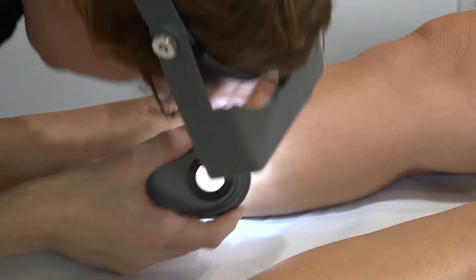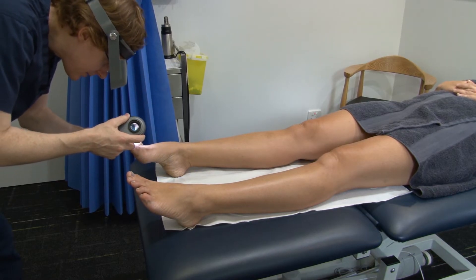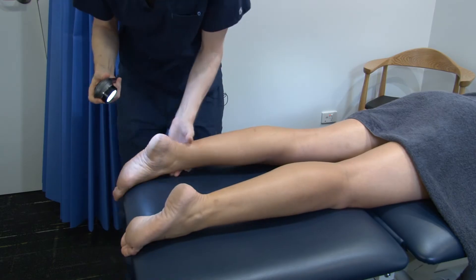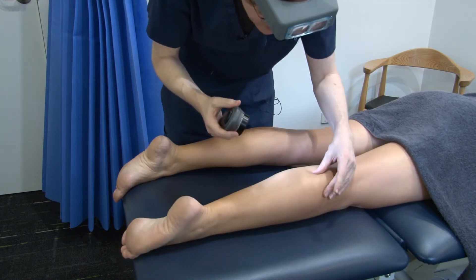With women, usually when I'm looking at their thighs or their shins, I mention: is there anything on your chest that you think I should be aware of? So they can have a look and say there's nothing going on, while I'm busy looking at their toes. Then either way I'm at the ankles. Make a big deal of looking at the feet, because you need the patients to understand that you have actually looked at their toes — for melanomas and web space things. Then ask the patient if there's anything on the front of them that they'd like me to look at that I haven't seen yet. Then lift their feet up to look at the sole of each foot — it doesn't help you that much, but they know you've looked at their feet.